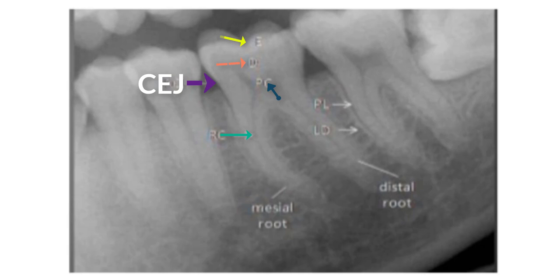We can't really distinguish on a radiograph the difference between the dentin and the cementum because they are similar in radiopacity and the cementum is a thinner layer around the root structure. Right where the enamel and the cementum meet is where we call the CEJ. Then we have the periodontal ligament space — that's a dark line surrounding the root structure. Because the periodontal ligaments are tissue, we can't see them on the x-ray; we can only see the space in which they are housed. The lamina dura is the dense cortical bone that surrounds the periodontal ligament space.